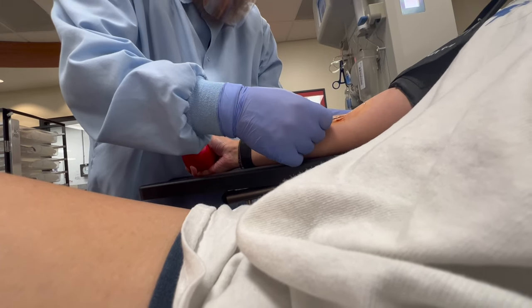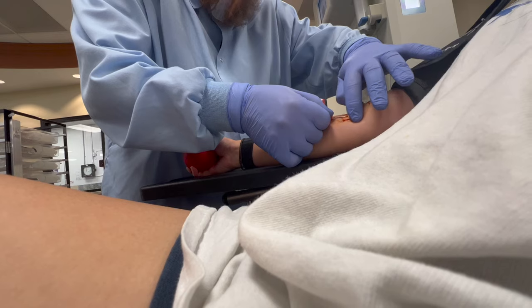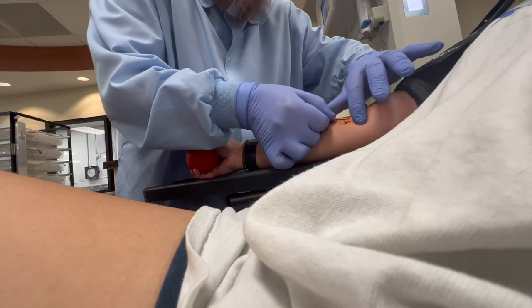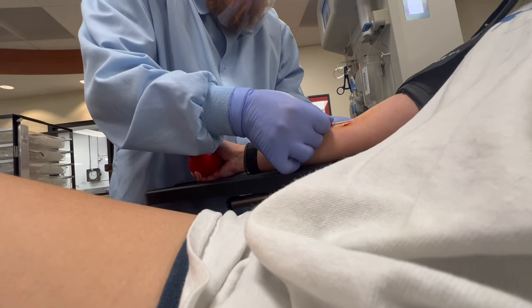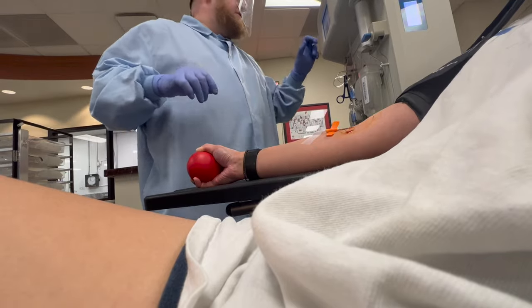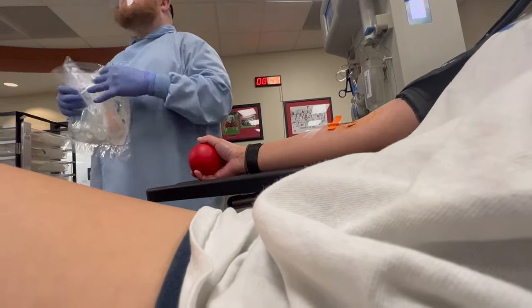This particular time was not a good stick, so here the phlebotomist is adjusting the needle to try to get it into a better position in my vein. I do have very small veins and they also roll, so it is kind of difficult to be honest.